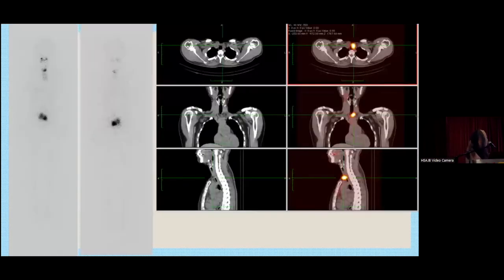Okay, this is an image of a patient where you can see that there is normal oropharyngeal uptake, stomach uptake and intestinal uptake, but there is uptake in the neck and also a very subtle or mild uptake slightly lower. When we did SPECT-CT, we can see that it is actually the remnant of thyroid tissue, and maybe you can see it clearly here, there is actually a thymus uptake.